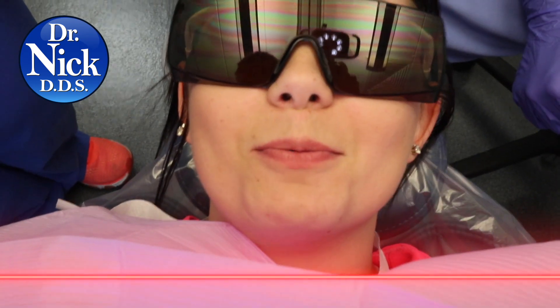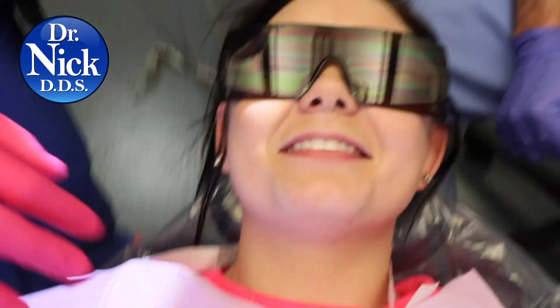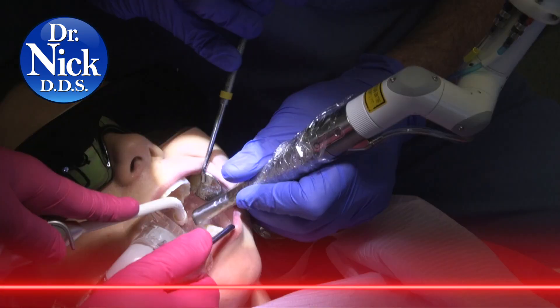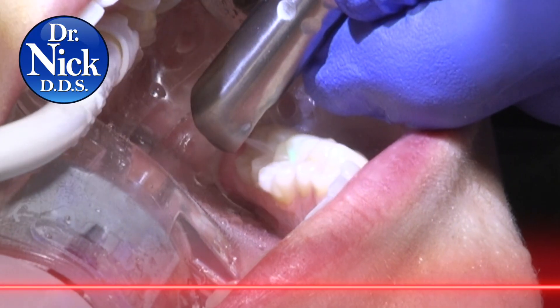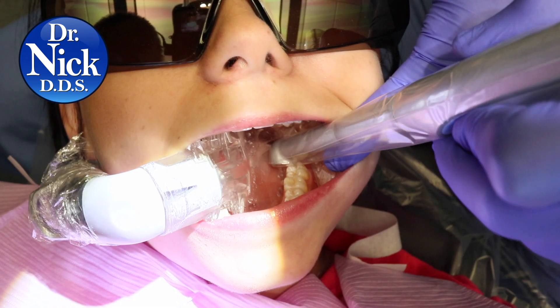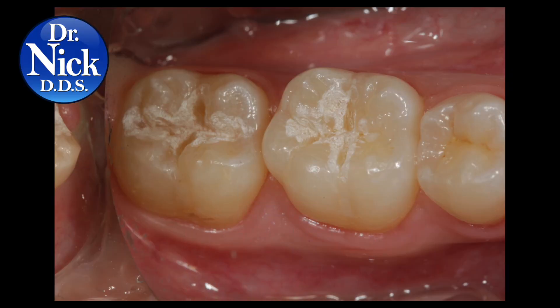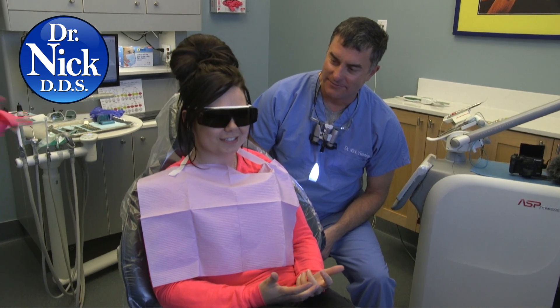If you have cavities, you need to brush — or just use the laser. The filling is done with this fancy machine called a Light Walker laser. No shot, no drill. Are you happy about that? Yes. Why? Because no one likes shots.